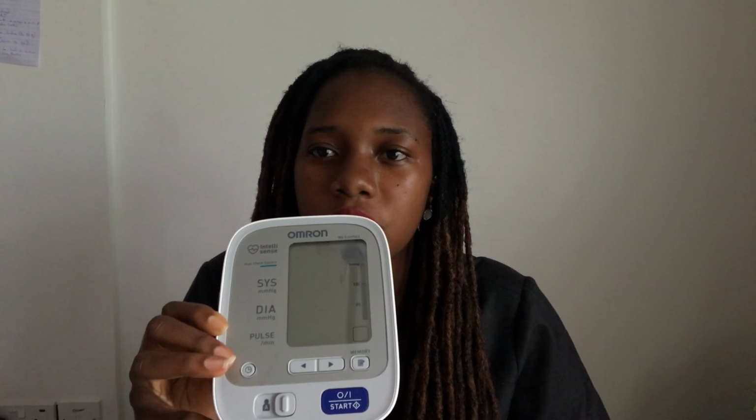Then the digital one has also this. This is like its monitor. The monitor has an on button. And actually these medical digital machines are very easy to use. So you put on the power button, and if you put on the power button, it will start inflating.